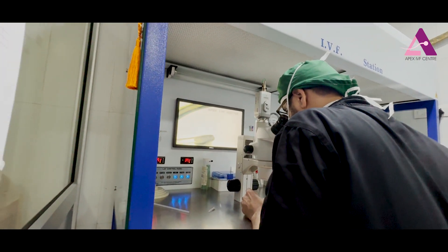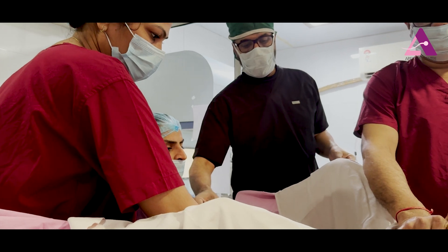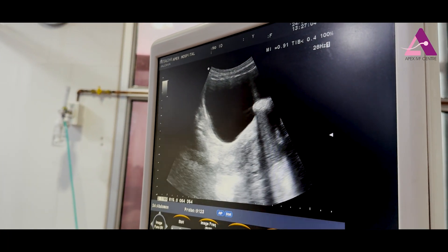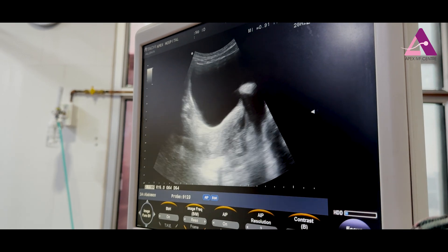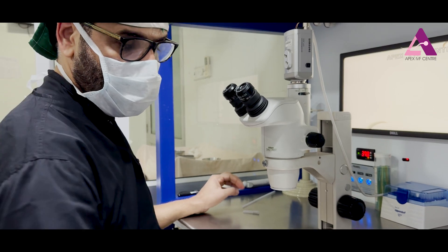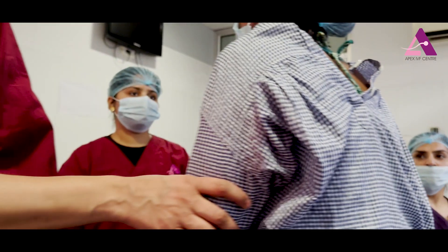The gynecologist is ready with the outer catheter, and the embryologist is bringing the embryo. You can see on the screen how the catheter is coming inside. The patient is watching the embryo transfer, and now she is getting up and going to walk.